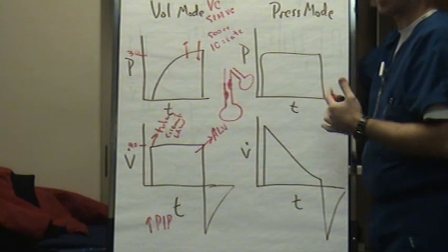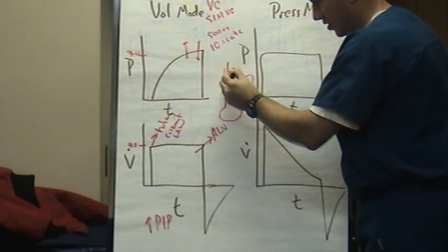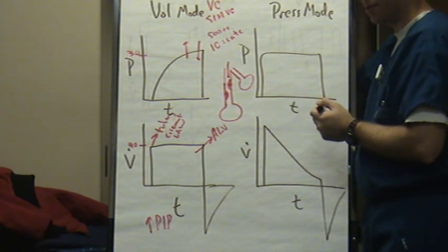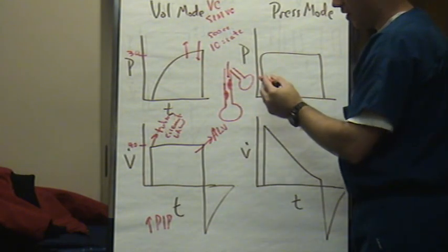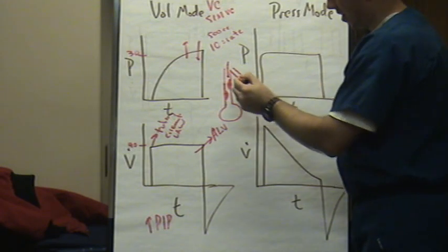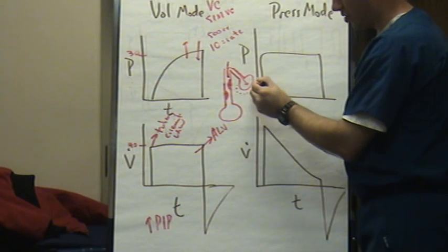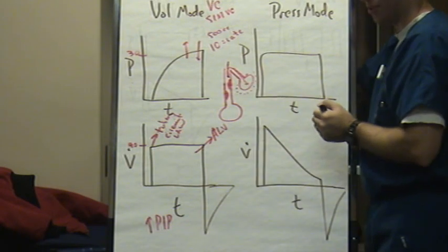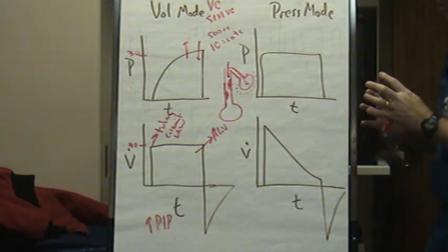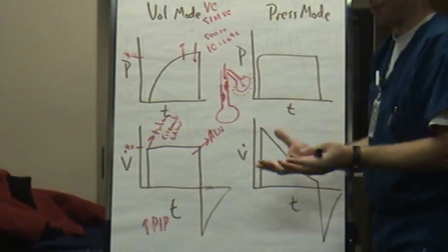What might be happening on your x-ray? If you see this happening, because you know you're going to hit that, is it going to get through it or is it going to turn around and go somewhere else? It's going to go somewhere else. And if you have healthy lung right here, where's it going to go? Yeah, bad news. Look what it's going to do. It's going to come over here to the healthy lung to the point that we might start overinflating that one. Y'all see that? That's how these lungs get sicker and sicker, for lack of better terms, by just us having them on a ventilator.